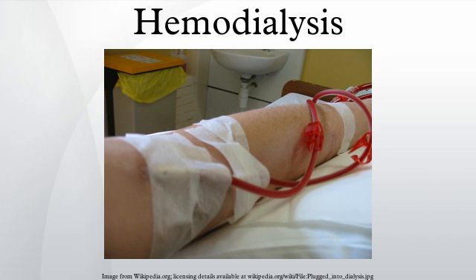Membrane and flux. Dialyzer membranes come with different pore sizes. Those with smaller pore size are called low flux, and those with larger pore sizes are called high flux. Some larger molecules, such as beta-2 microglobulin, are not removed at all with low-flux dialyzers. Lately, the trend has been to use high-flux dialyzers. However, such dialyzers require newer dialysis machines and high-quality dialysis solution to control the rate of fluid removal properly and to prevent backflow of dialysis solution impurities into the patient through the membrane.